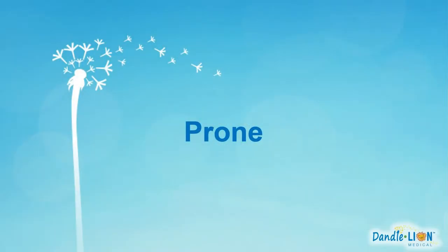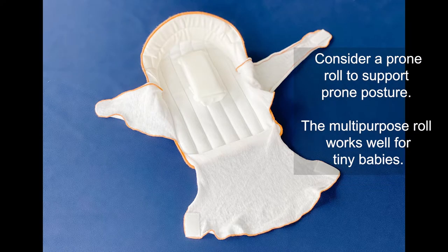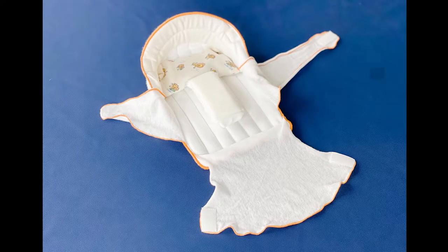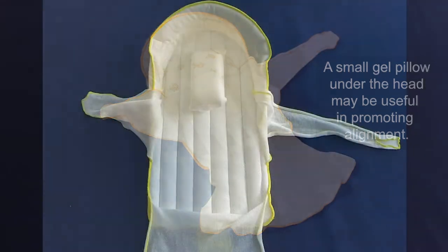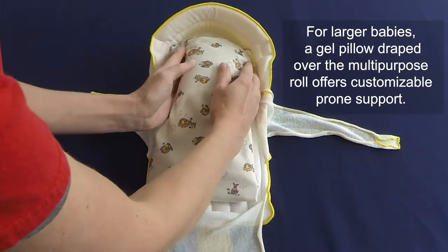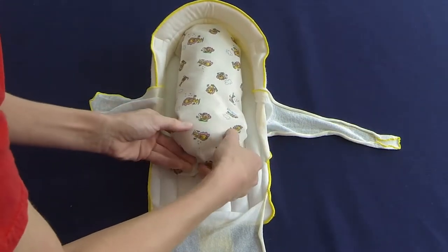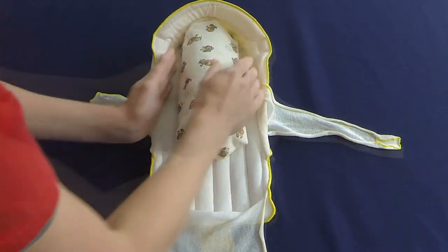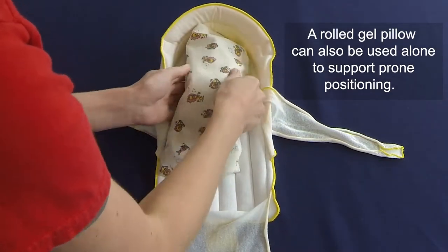When positioning in prone, consider use of a prone roll. For smaller babies, the multipurpose roll can be used inside or underneath the Rulite as a prone roll. Adding a gel pillow beneath the head may help keep the head and neck aligned while ensuring proper prone posture. For larger babies, a gel pillow layered over the multipurpose roll works well as a prone roll; the edges can be tucked under to optimize the size and ensure a proper fit. A gel pillow can also be used alone to support prone positioning.